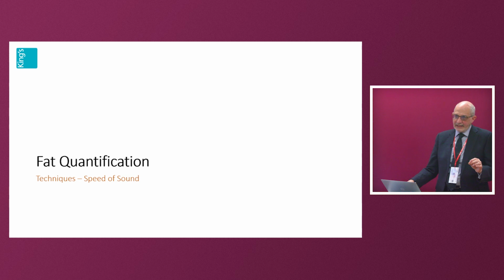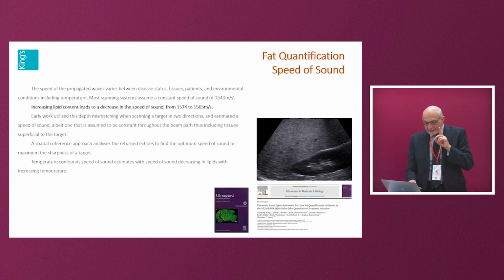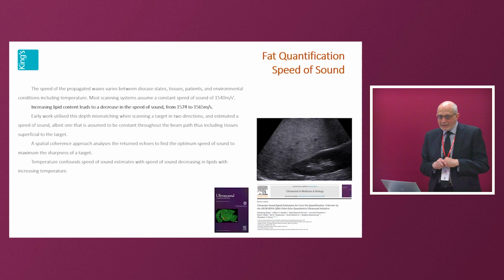Then you've got the third technique, the speed of sound. Now the speed of sound is actually interesting, but whether or not it comes to clinical fruition is a different matter. It's been around for about 30 or 40 years, and it's well known that there are different speeds of sound through different tissues, but we all assume it's 1,540 meters per second, full stop. But if you've got an increasing lipid content, the speed of sound is slower. But look at the values, it's very, very marginal. So you've got to have something that's sensitive enough to measure this change.